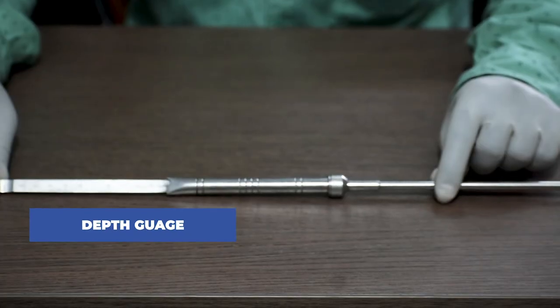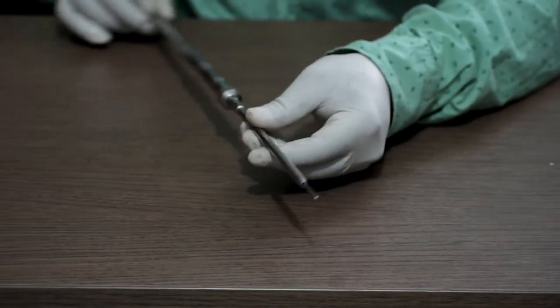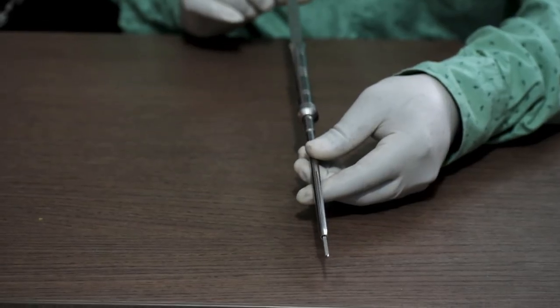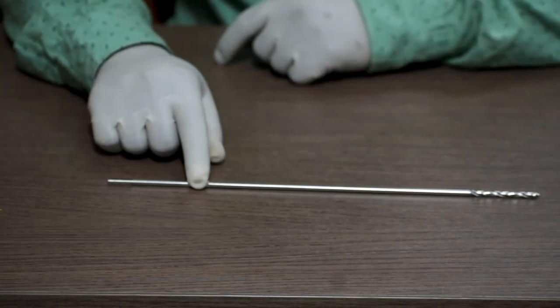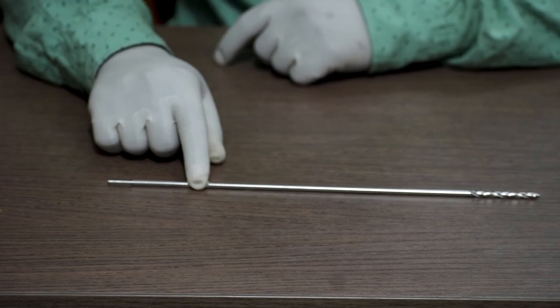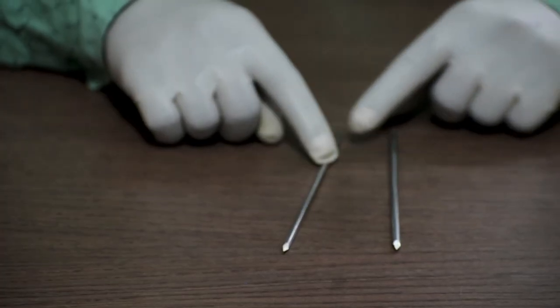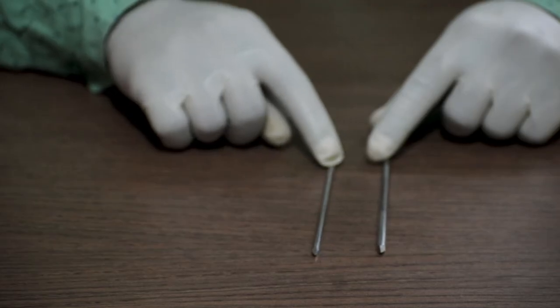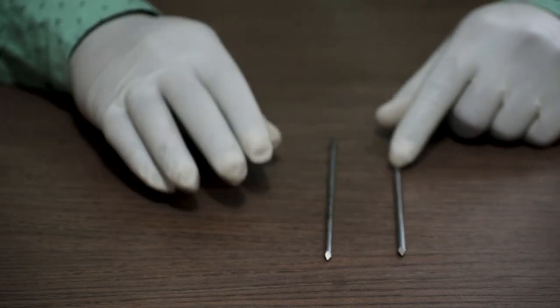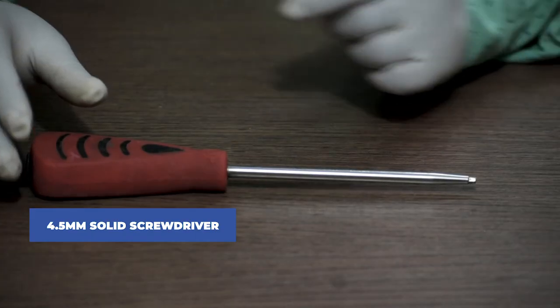Next is depth gauge. This is a long depth gauge, generally used for nailing systems. Next, 4 mm drill bit. Generally available in the length of 300 mm. Next, Steinmann pins. Given in two sizes, 3.5 mm and 4 mm. Generally available with the length of 150 mm. 4.5 mm solid screwdriver of 150 mm length.